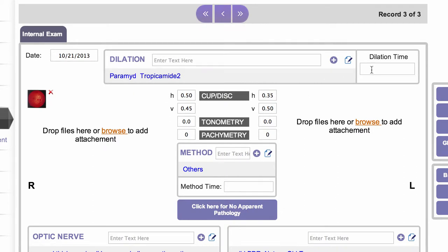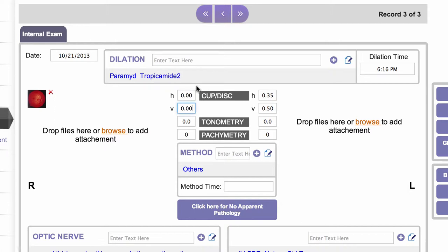You can record the dilation time simply by double clicking and it will put in the current time of day. Next would be the cup to disk ratio. If the horizontal and vertical are the same, you can type in the horizontal and just tab and it will repeat the same value in the vertical. Same thing for the left eye.